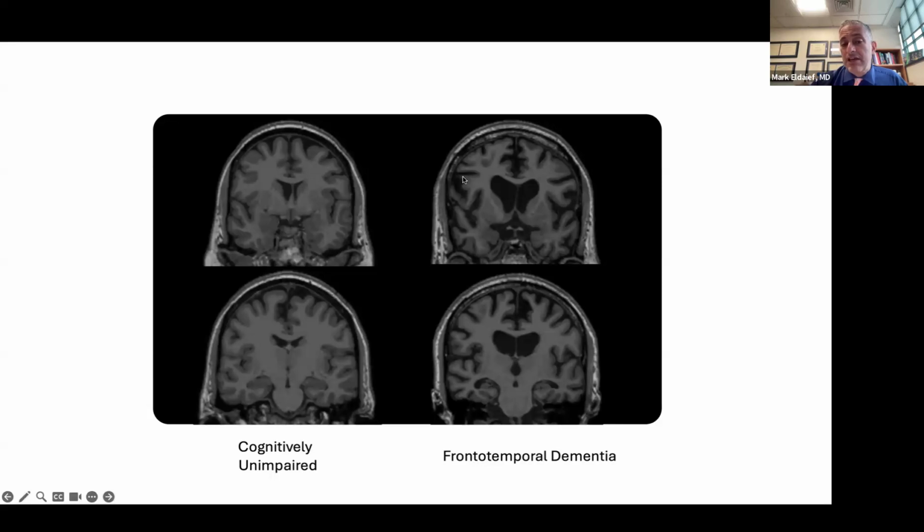What that means is that the gray areas, which is the brain, have shrunken, and they've been replaced by this blackness, which is just fluid that's taken up that real estate because there's been shrinkage. And again, these are the cavities in the middle of the brain. Everybody has them, but the person on the left has them nice and small. Here on the right, they've expanded because they're taking up the space left by the shrinkage on the outside of the brain.